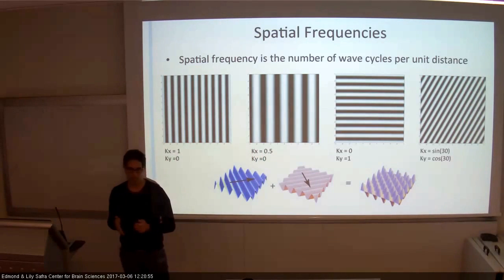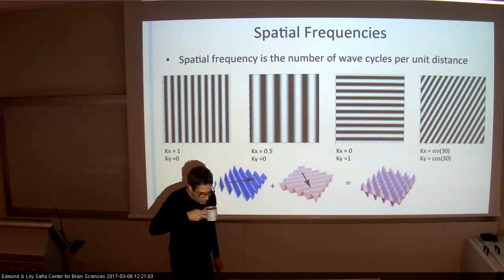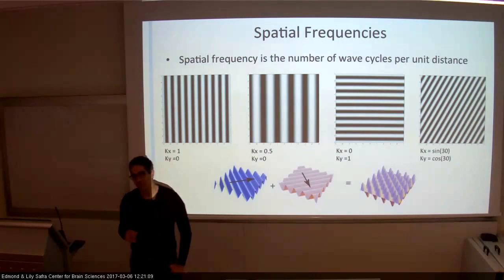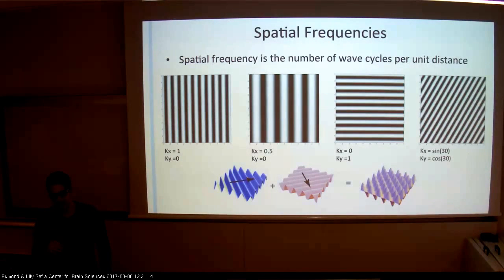Okay? That's fine? And for the pulses, do you also vary the energy of the pulse, which needs to be different for different magnetization? So do you also vary it, or do you just use the pulse that's combined? We do. We have gradients in X, Y, and Z, and we can create any combination of those according to the strength. Is that what you're asking, like for the pulses, for the 90 and 180? No, those are not, but there will be additional pulses which will create the gradient in space.